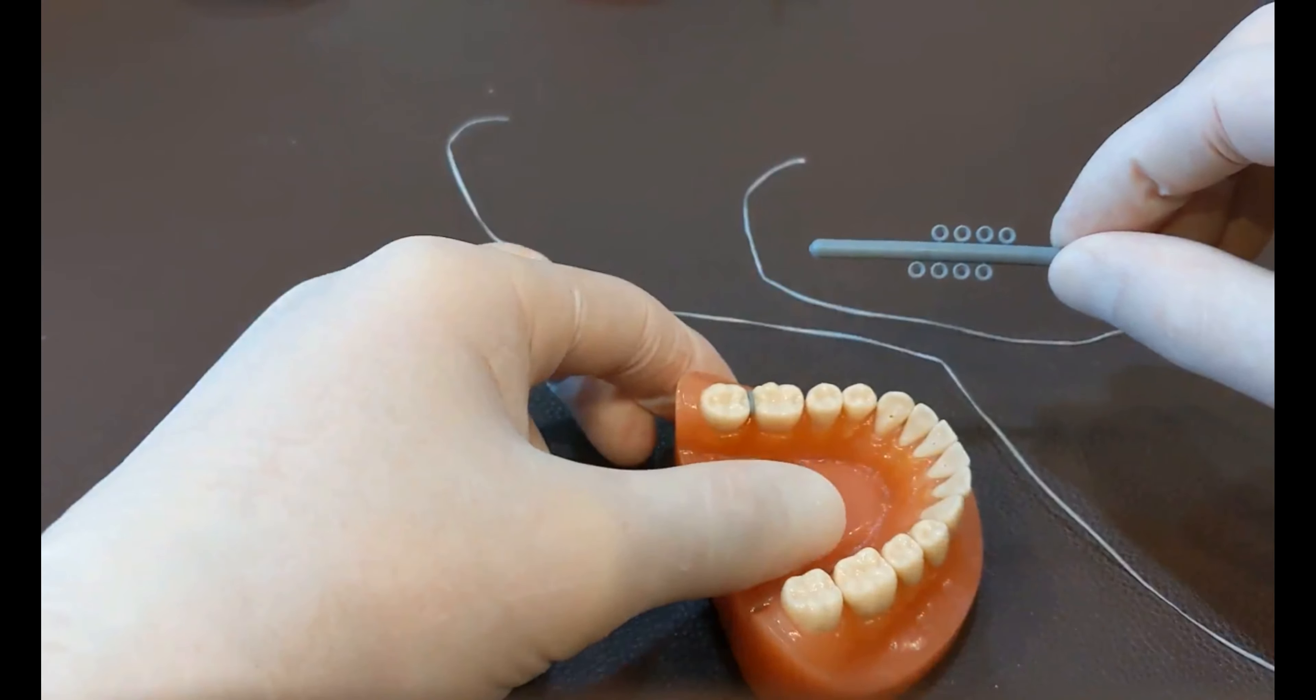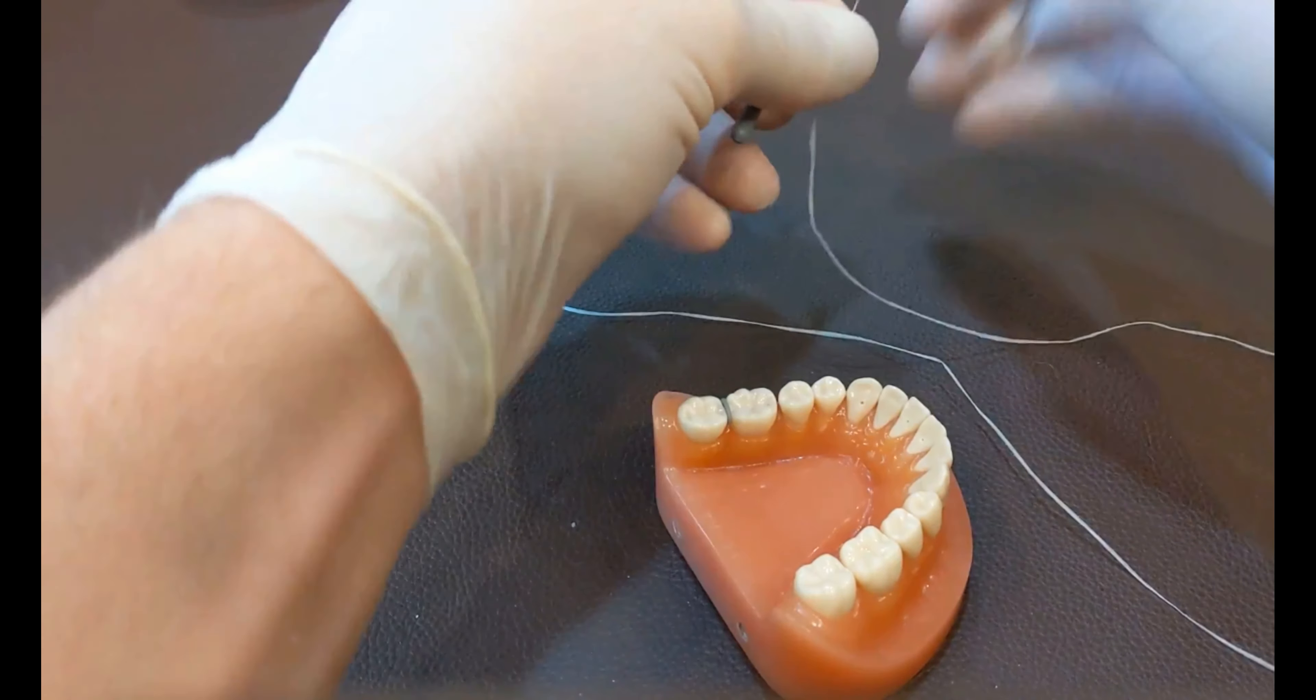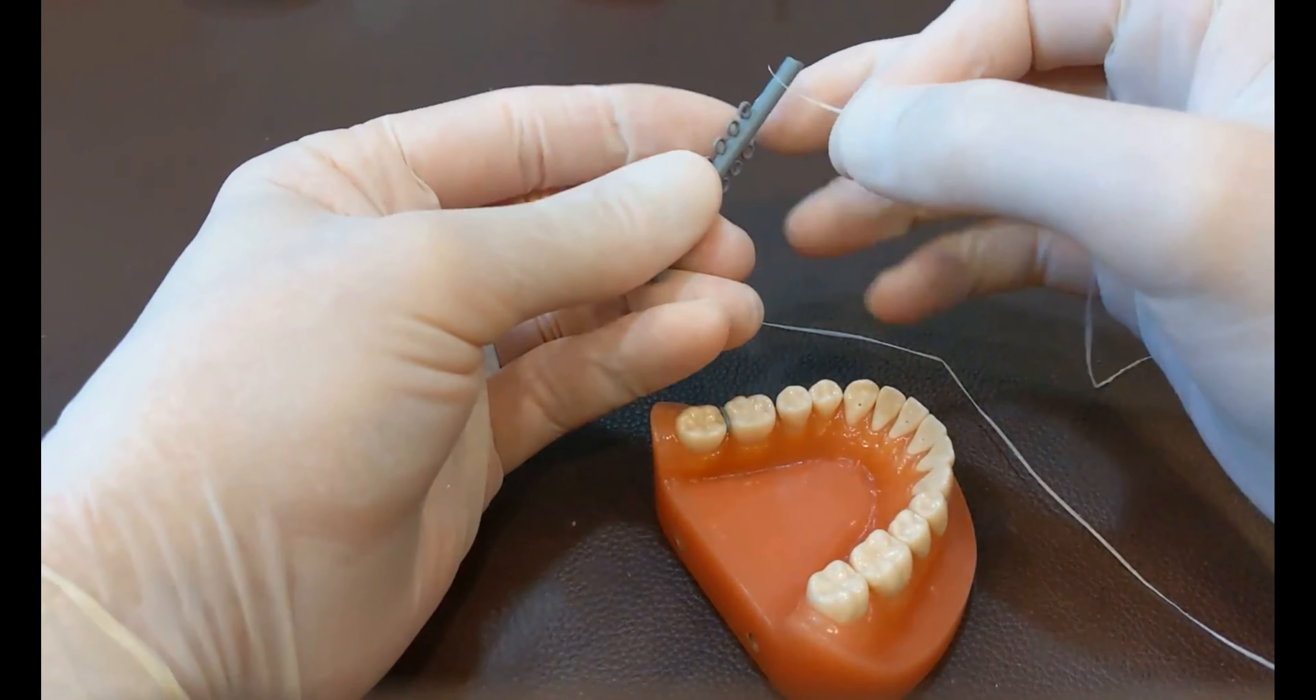So what you do is you get your separators. They come in a little thing like this. There's two ways of putting them in. This is the floss way. This is the way I personally prefer.